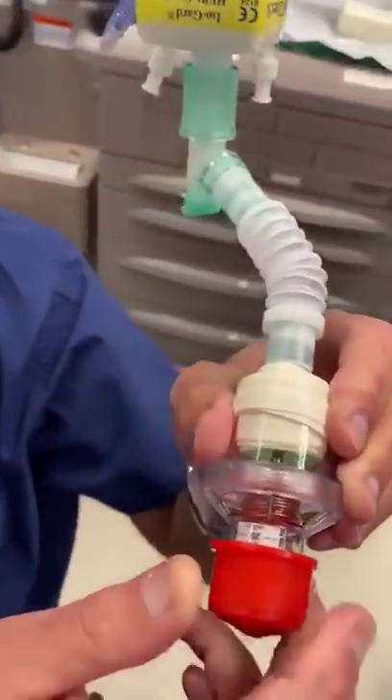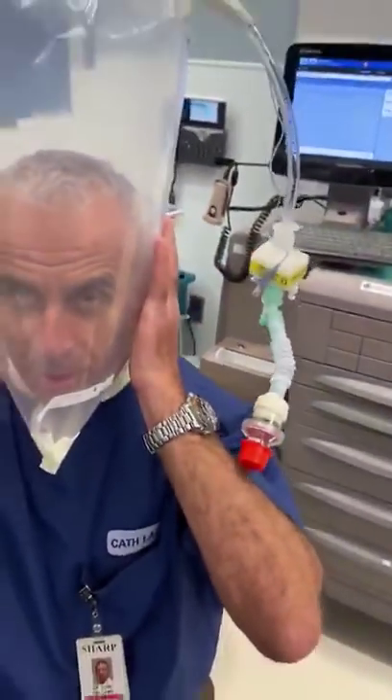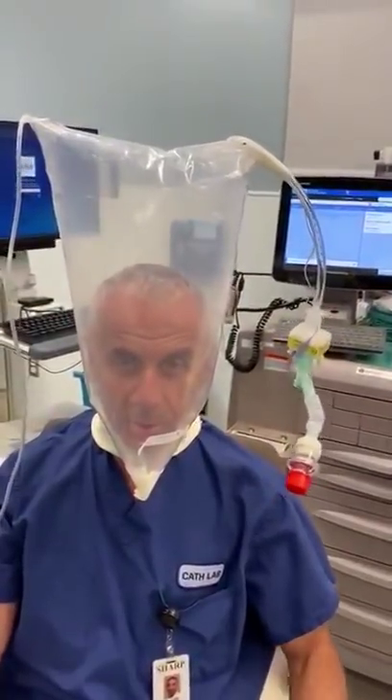And I can adjust the PEEP here, and you see it's becoming really, really hard for me to breathe with a tracheal PEEP.